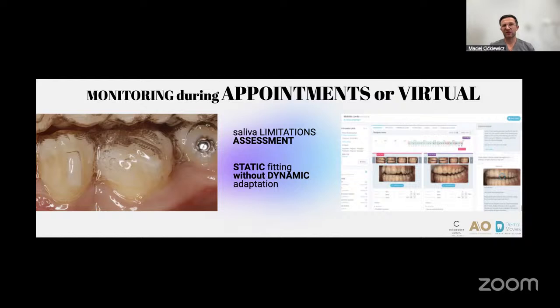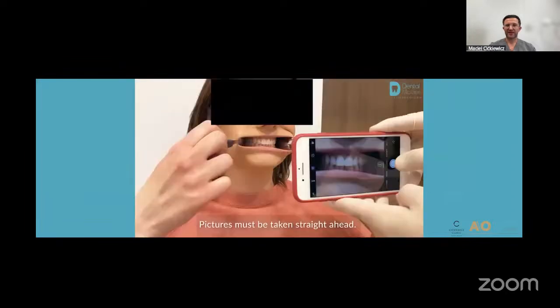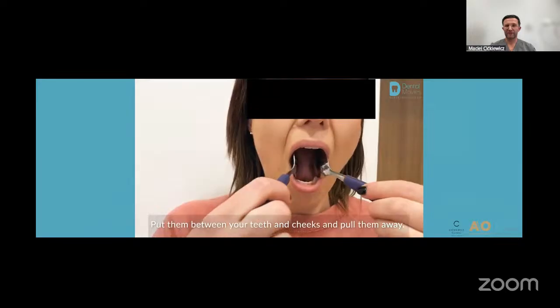If something is wrong like that, it's better that the patient appears directly at the visit, not losing your time through these elements of chat and scanning all the time the whole data. And if you analyze it, you can see, of course, a different way, because sometimes patients make consultations and send you very nice photos by using spoons. These are options like in the pandemic time.